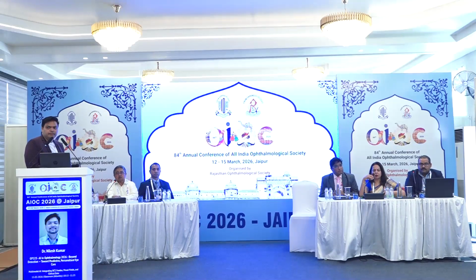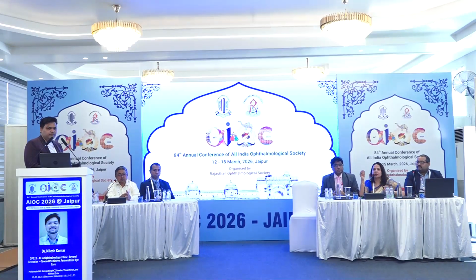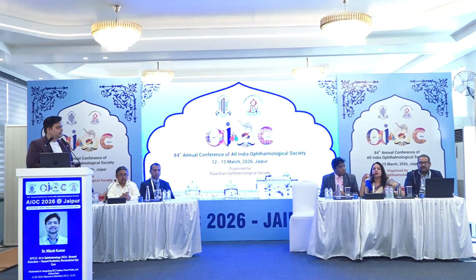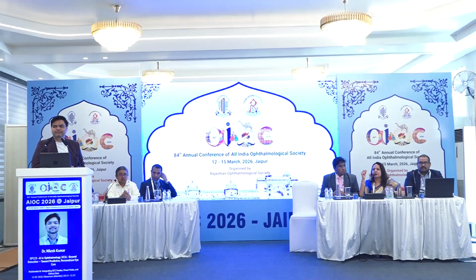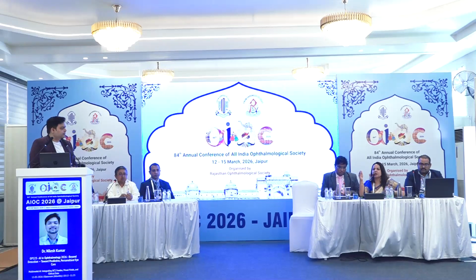I'd like to bring in a couple of points here for the benefit of our audience who might suddenly find this talk at a much higher level, who are not aware of what a single AI is versus a multimodal AI. So far we have been developing algorithms to diagnose just one disease, like diabetic retinopathy, labeling the data for diabetic retinopathy or ARMD or glaucoma, and getting one endpoint result. So that becomes very disease specific, and there is always the risk of losing out on something else which might be present in the same retina.